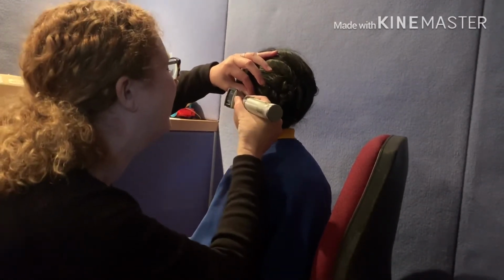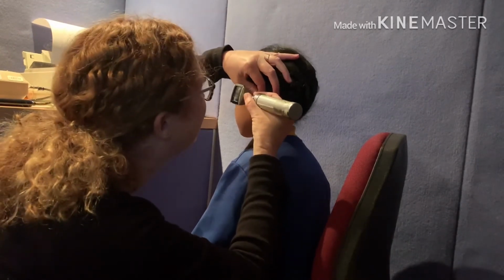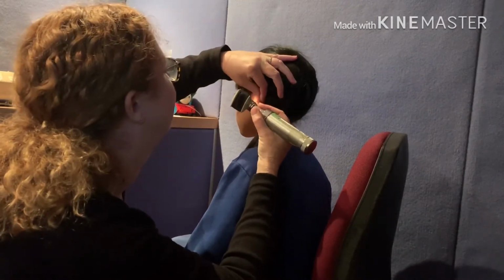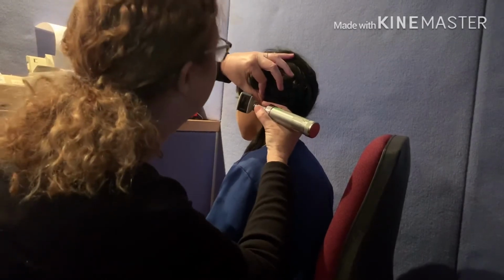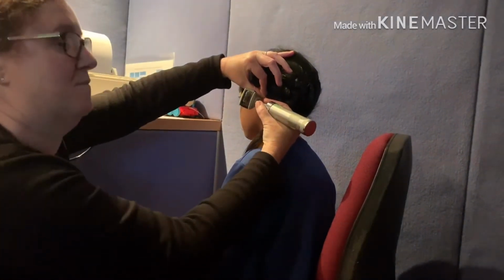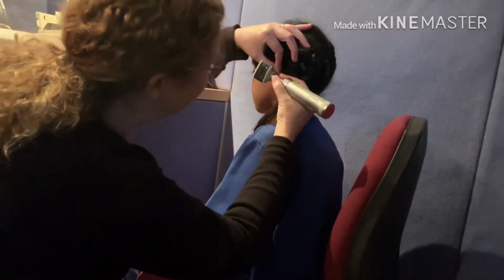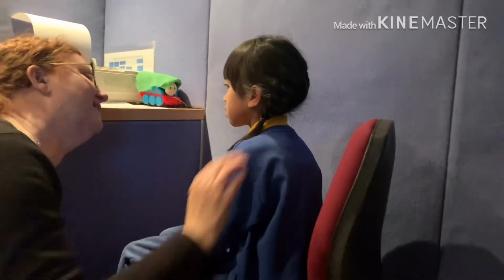Okay. Sorry. I don't want to hurt her ear. Oh, there we go. Oh, yeah. So that's the light reflex. Very good ears. Excellent. Nice and clean too.